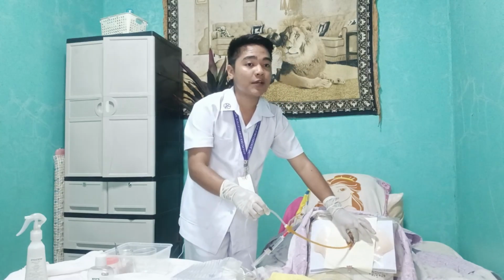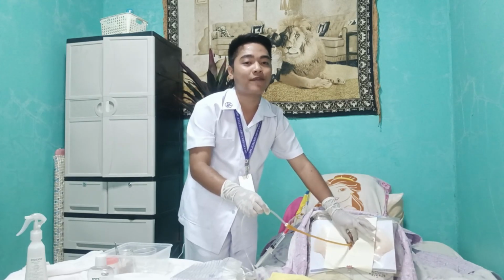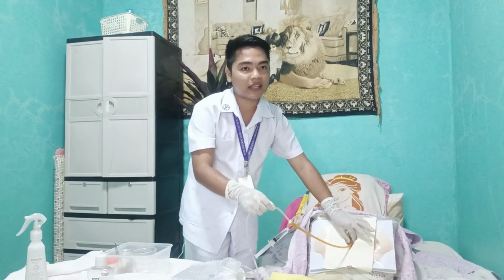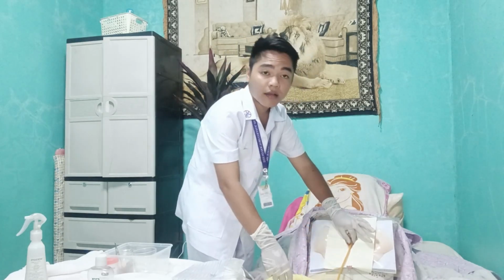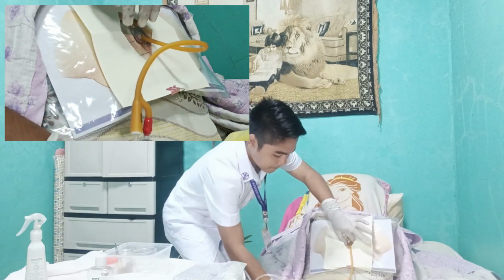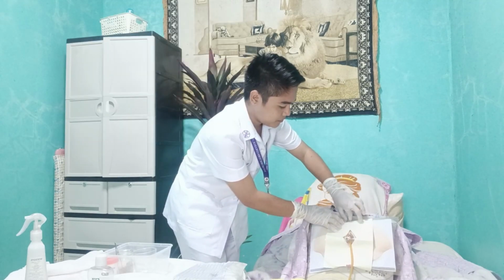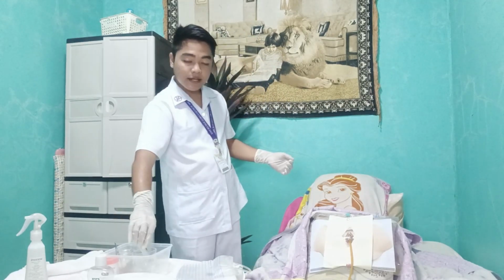Next thing to do is to inflate the balloon with 10 to 15 cc of sterile water, so the balloon will prevent the catheter from slipping out of the patient's body, and also when the catheter needs to be removed, the balloon will be deflated. Okay. All right. So let's put it here.